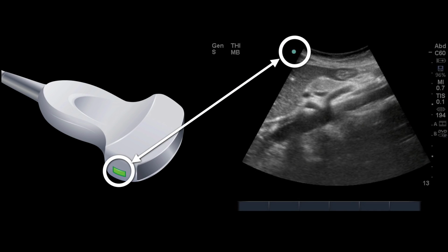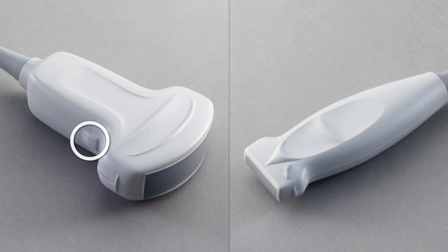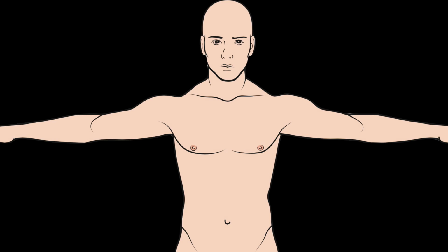So let's discuss orientation and planes. There's an indicator on the probe, which aligns with the indicator on the screen. Unfortunately, indicators may vary by probe and by manufacturer. Orientation is based on the indicators, and for body orientation or abdominal preset orientation, the indicator will be pointed towards the patient's right, the patient's head, or somewhere within that 90-degree range.